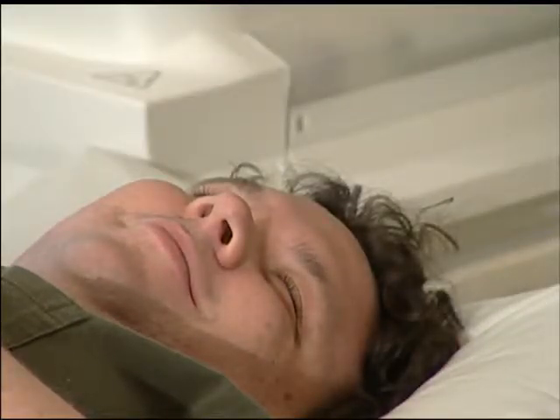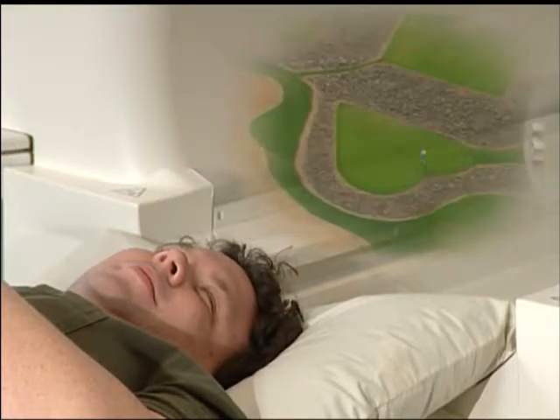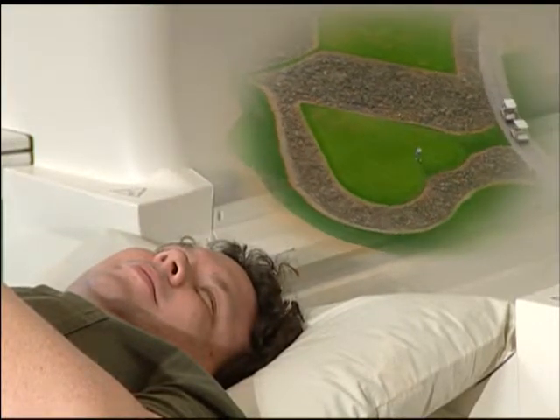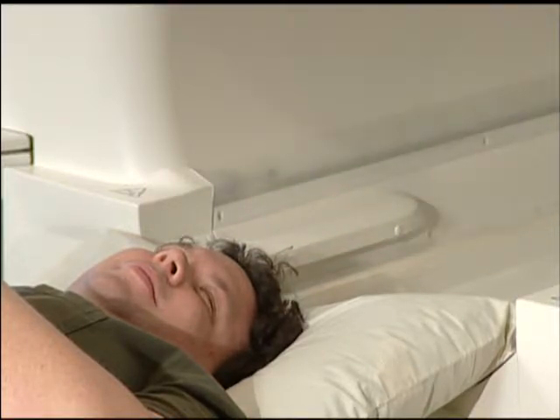Patients often try to nap. Mr. Smith enjoys golfing a lot. Perhaps he's thinking about his favorite course, concentrating on how relaxed he feels when he's playing. Think about something you enjoy doing. It really helps. Once complete, your magnetic resonance images will be processed and sent to your physician, who will discuss the results with you.